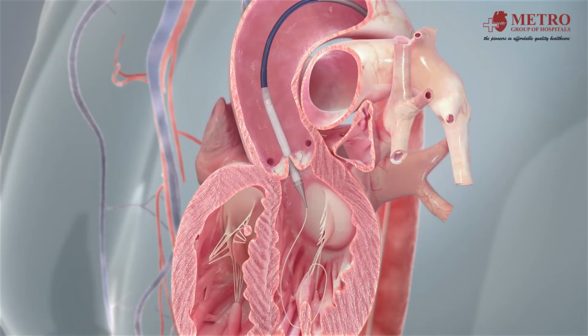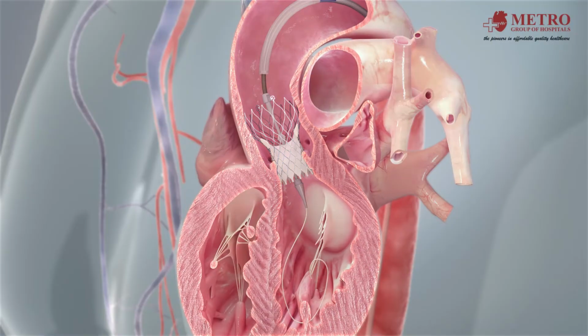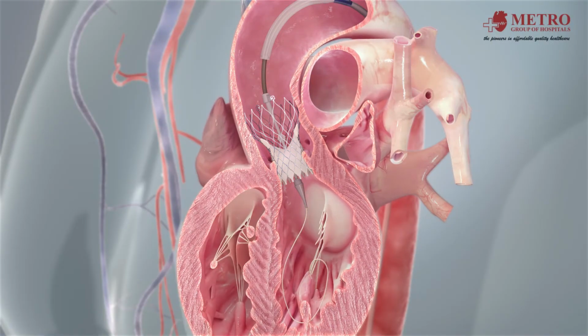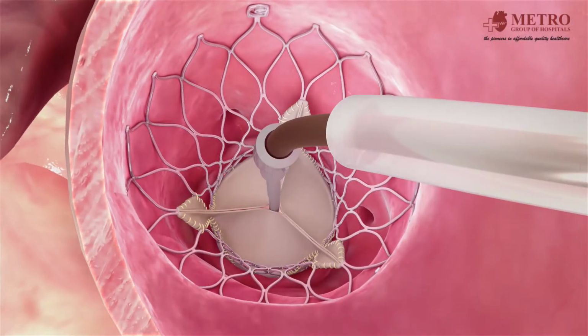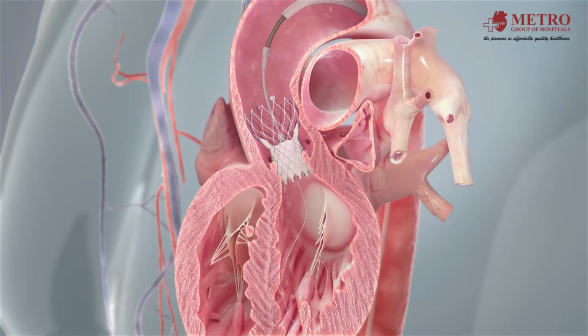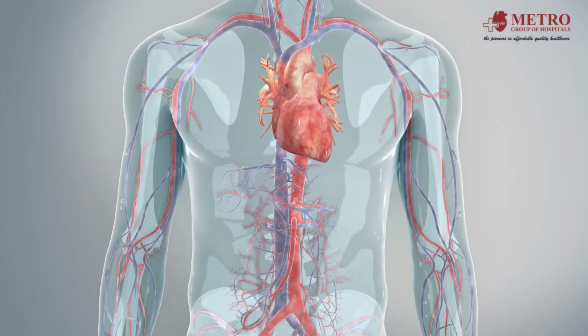Once in place, the self-expanding frame of the Medtronic heart valve enables your doctor to deploy it in a controlled and accurate manner. After expanding, the new heart valve takes over the old valve's function to help blood flow efficiently out of the heart. Once the valve is accurately placed, the thin flexible tube will be removed, the cut will be closed, and the procedure will be complete.